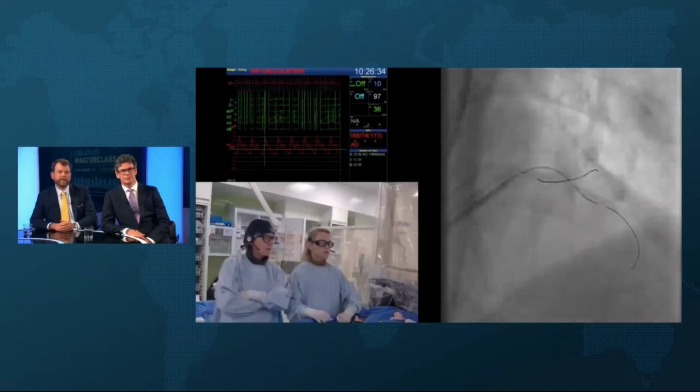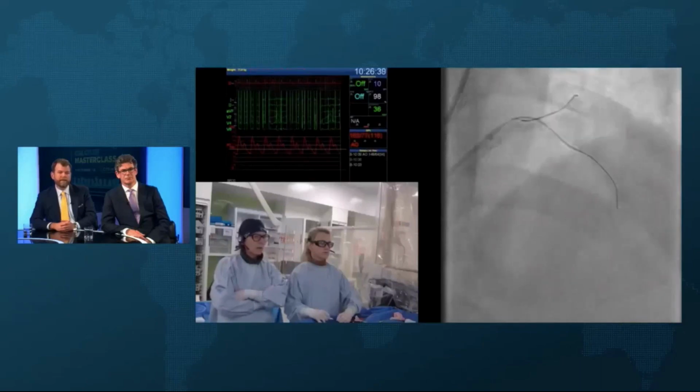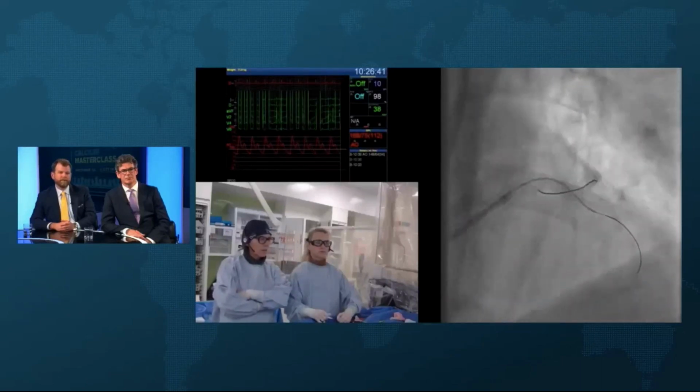around in the aneurysm coming back. It can just be a challenge, right? Because that thing can be 2, 3, 4x times the rest of the vessel. Yeah, I agree, Rob. That's what I was going to suggest as well.